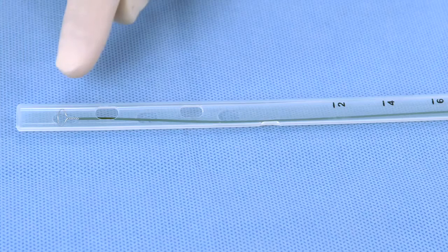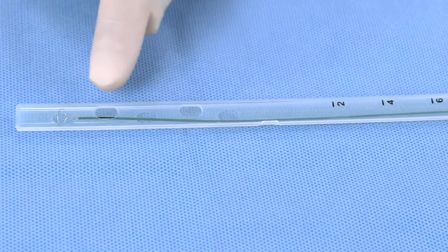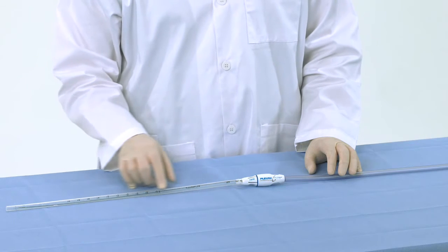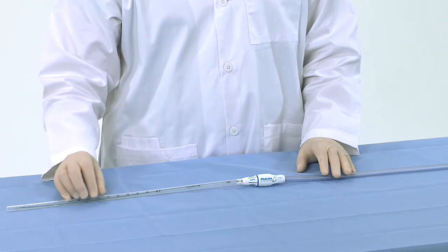Recall that the device is parked with the loop completely inserted into the chest tube. This puts the loop past the drainage eyelets along the side of the tube, leaving a clear path for blood to enter the tube through these eyelets and be removed by suction to the drainage canister. This allows free flow of shed blood in the chest through the eyelets to the open lumen of the chest tube, which is patent to the drainage canister.